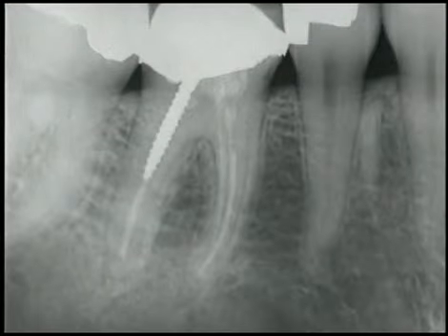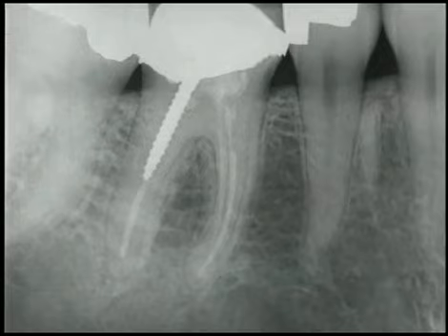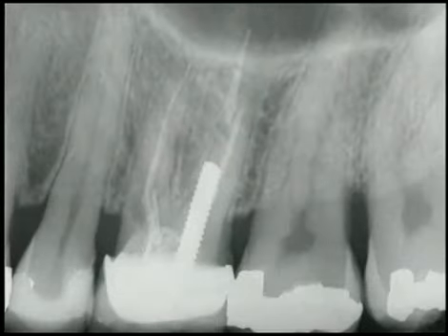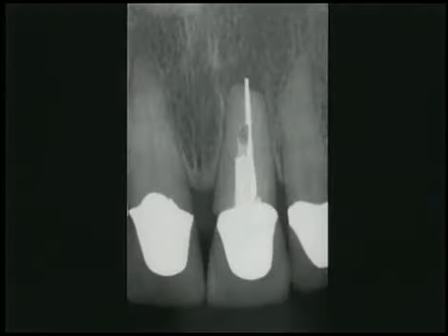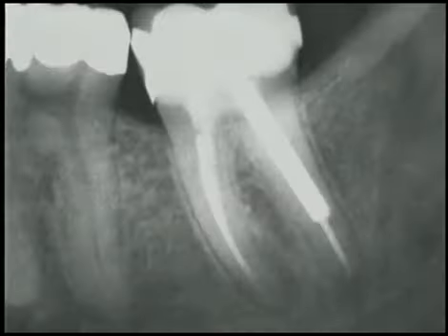Here we have a large threaded screw post. Notice the canals are underfilled and underextended. This parallel post needs to be removed to address serious pathology in the root canal systems. This tapered cast post is short of the post preparation and is off axis. Here, a massive parallel post has significantly weakened the root. Weighing risk versus benefit, surgery may be best.